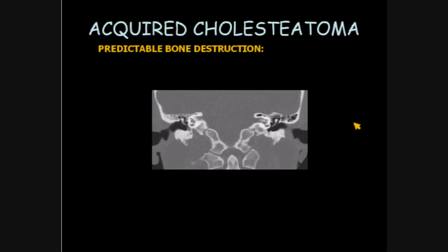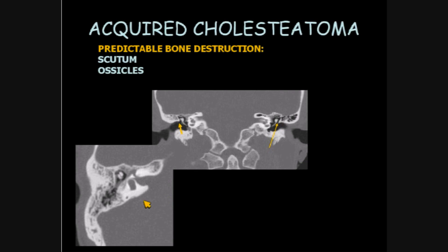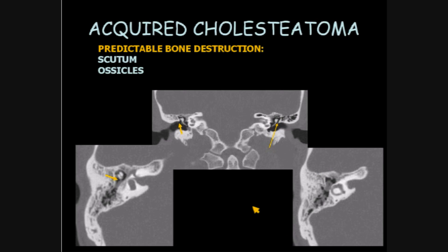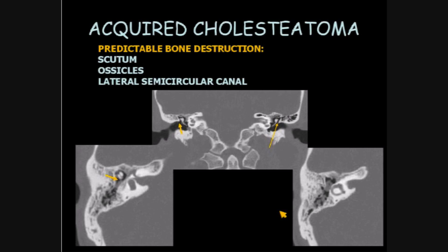Acquired cholesteatomas have predictable bone destruction. Erosion of the scutum is especially common — on this side we have an eroded scutum when compared to the normally sharp scutum on the opposite side. There's typically erosion of the ossicular chain; in this case, the body of the incus is absent, or for the most part, absent. Advanced cholesteatomas are associated with lateral semicircular canal fistuli, and this demonstrates some thinning and some erosion of the cortex of the lateral semicircular canal.